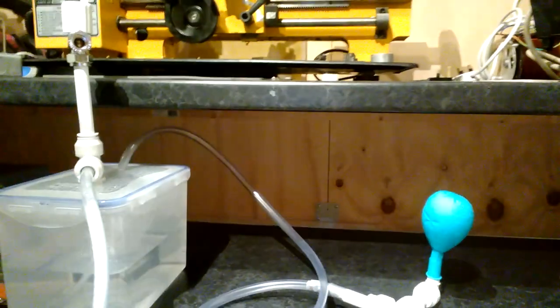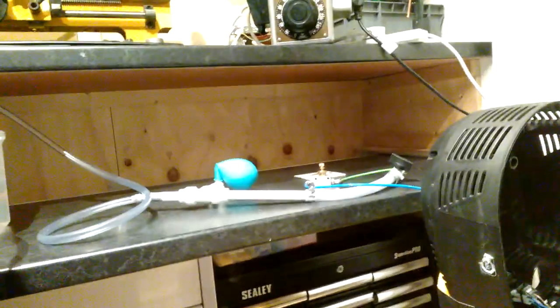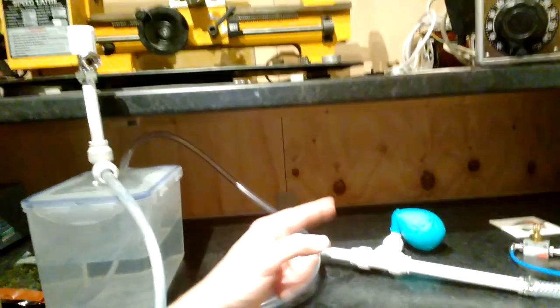That's a very low pressure compared to the source. That's an extremely low pressure compared to what we've got in the cylinder, which is compressed to 8 bar. So you can see with this really simple setup, we've been able to reduce 8 bar in that cylinder to only 60 millibar, or less than 60 millibar, which is a safe pressure for your lungs to breathe.